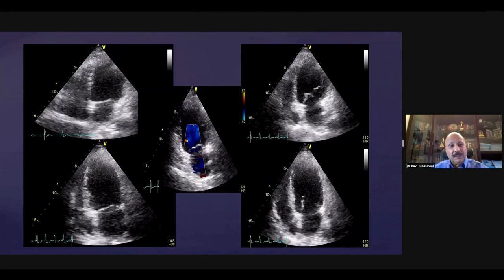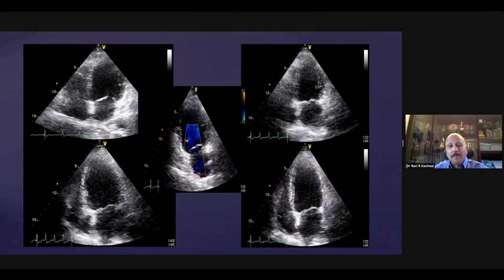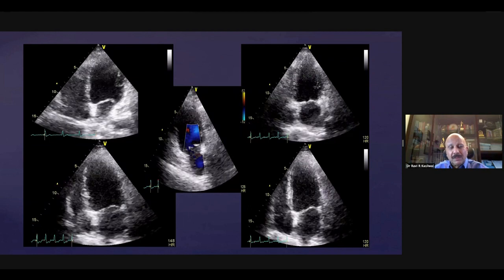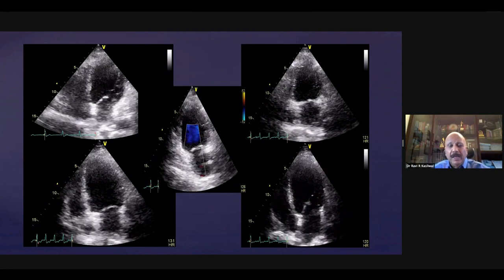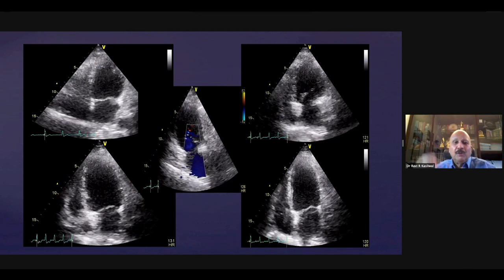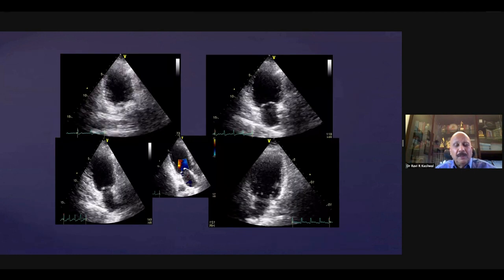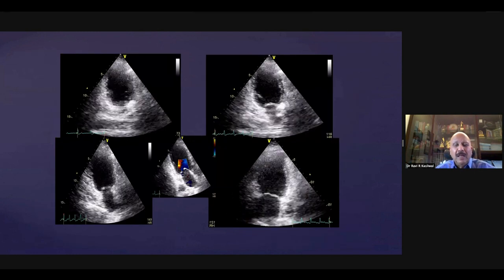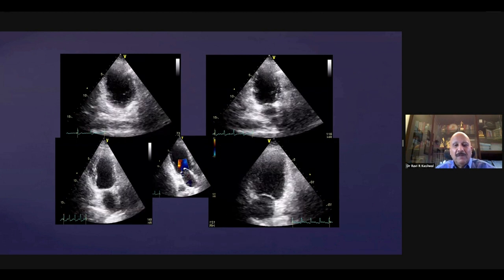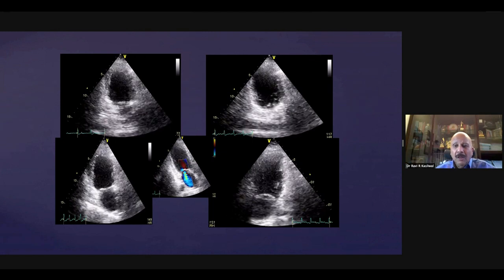So mitral regurgitation, diastolic disturbances, or a restrictive inflow, all these things give us far more information about the hemodynamics taking place in this particular patient. See this very clearly. You can see wall motion abnormalities, and of course, you can see mitral regurgitation at peak exercise in the 3-chamber position.